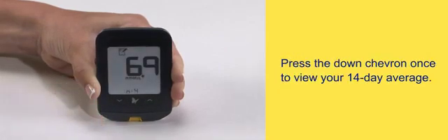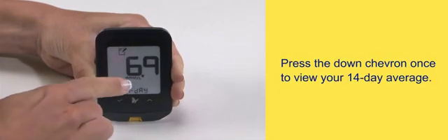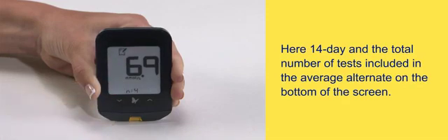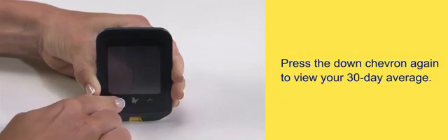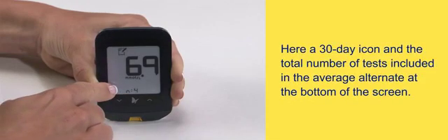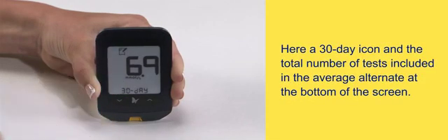Press the down chevron once to view your 14-day average. Here, the 14-day icon and the total number of tests included in the average alternate on the bottom of the screen. Press the down chevron again to view your 30-day average. A 30-day icon and the total number of tests included in the average alternate at the bottom of the screen.